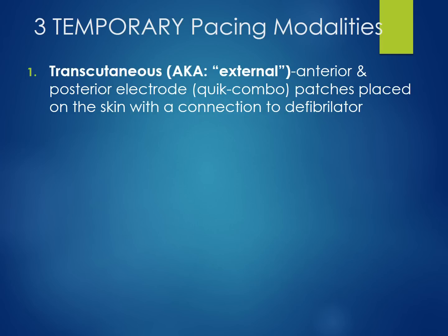Well, there are actually a few different kinds of devices we can use to pace a patient's heart. And the key difference to be aware of is when each would be most appropriate, and also the risks that are posed with each way we pace a patient. So here we're going to discuss the temporary pacing modalities. This is not a long-term solution, and it actually requires a power source outside the body.